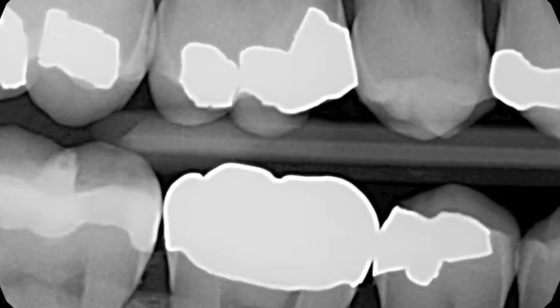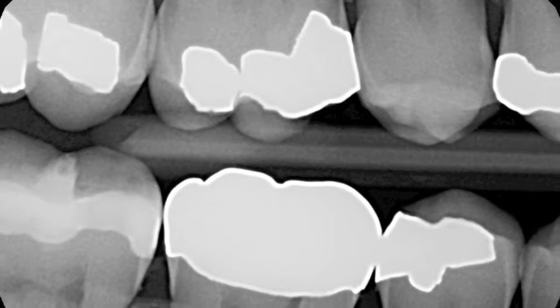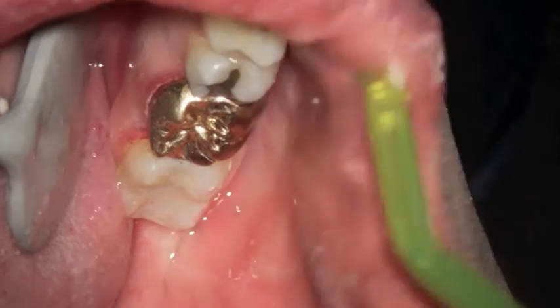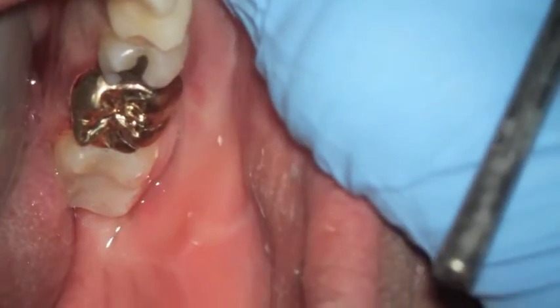Looking at the tooth, it looks fine, so we take an x-ray to verify that the margins are closed, and you can see how the area that's white against the tooth there was completely sealed.